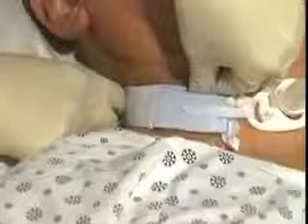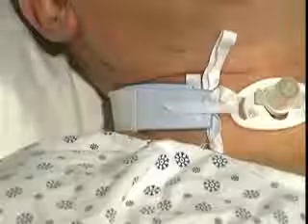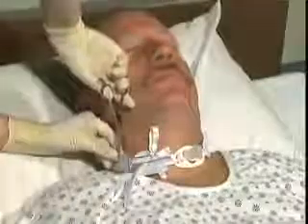Adjust and secure the fastener tab on the short portion of the neckband to the soft material on the long portion of the neckband for proper length and compression. Cut off excess material as required for a proper fit.